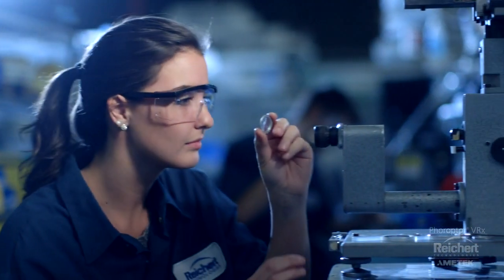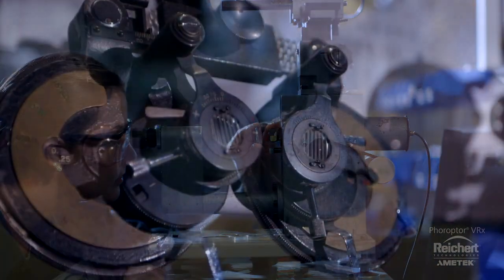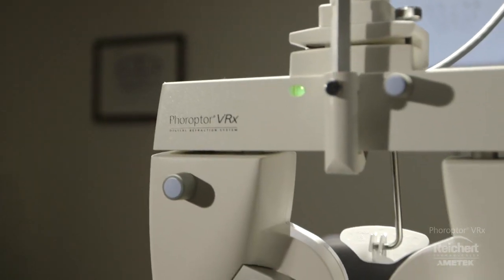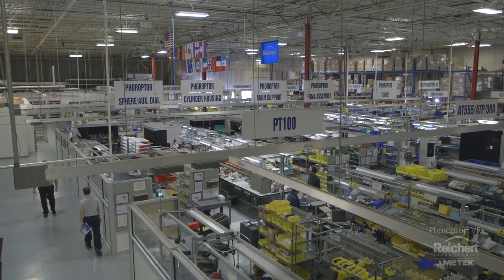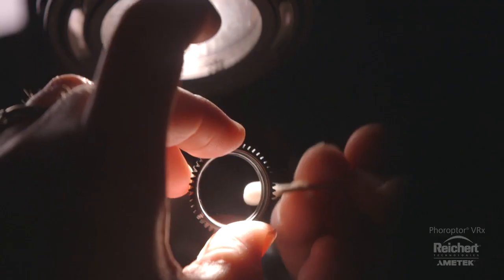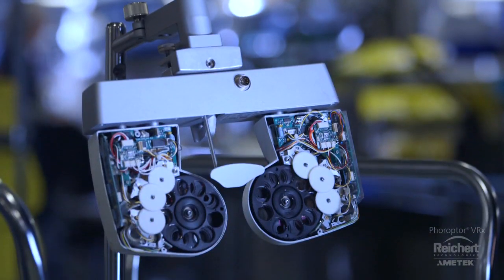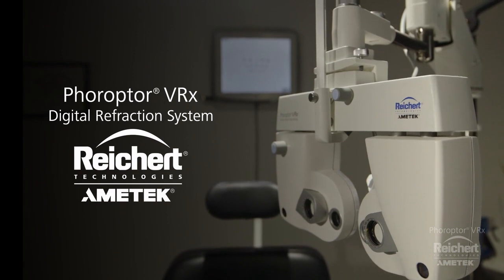Reichert's Phoroptor has been the standard in refraction for over 90 years. Phoroptor VRx continues to provide the same legendary engineering and reliability, now with the speed and efficiency of a digital refraction. Proudly made in the USA at our state-of-the-art world headquarters in Buffalo, New York. Phoroptor VRx — the most advanced Feropter ever built. From Reichert Technologies.